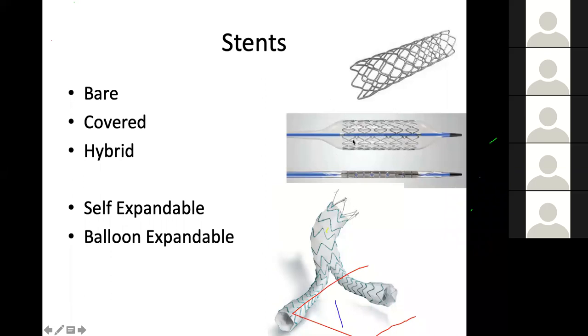Another difference between a balloon expandable and self-expandable is that a self-expandable stent which is made of nitinol has its own memory. Even if you press it and release it, it will come back to its nominal size because it is self-expandable. But if a balloon expandable stent has been deployed in the body and for whatever reason it gets pressed, this also will get pressed like this. So a balloon expandable stent is used in the inner parts of the body which are not compressible from outside, like the abdomen, whereas in the neck, which can be compressed, we use self-expandable stents.